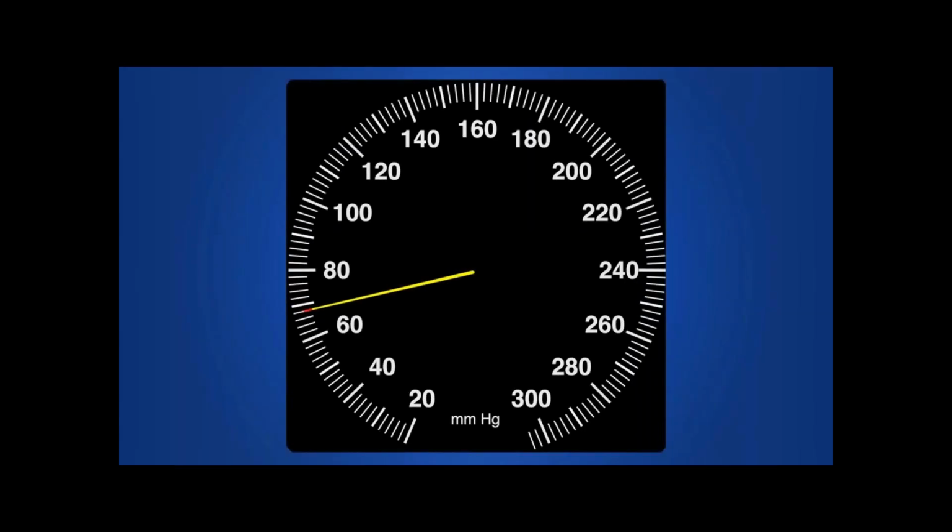The medium lines represent values of 10. This is 30, 50, 70, and so on. And the smallest lines represent values of 2. So this line represents 22, 24, 26, 28, and so on. Now let's use the needle to determine the number displayed on the dial.